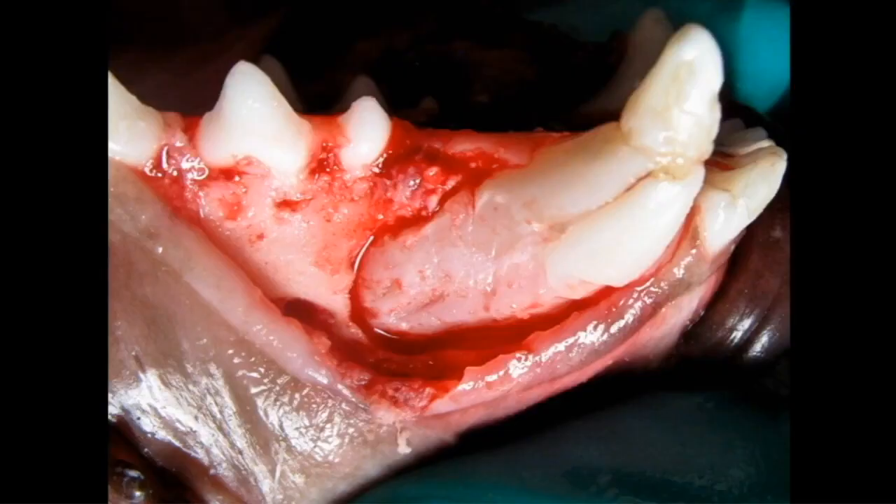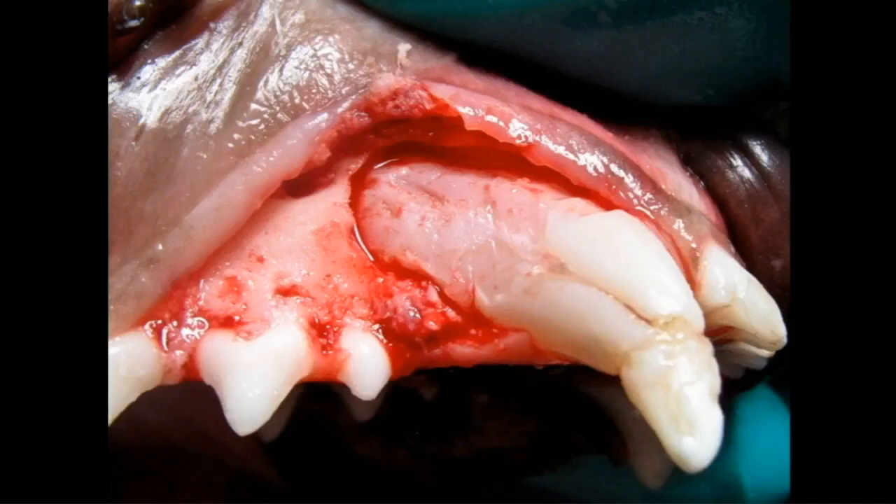Here is an image of another tooth showing the exposure we get with our surgical extraction. We go down to the mental foramen peeking out from underneath the gingiva where we've removed the vestibular bone, made our little grooves around the tooth, and we're ready to place our luxator. But if we put the luxator in from the top, we're going obliquely backward — we don't want that. We want the patient positioned so we can go directly from us to the patient.